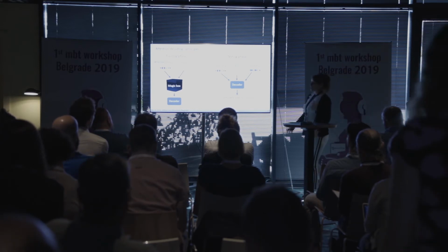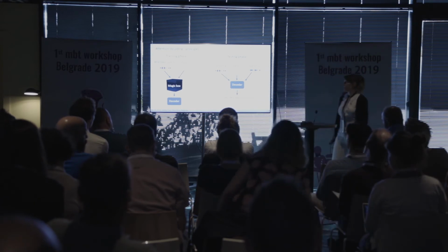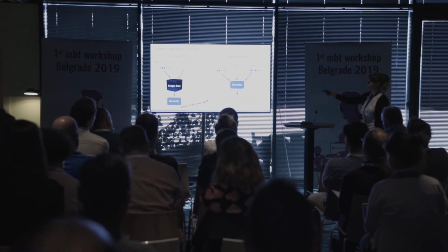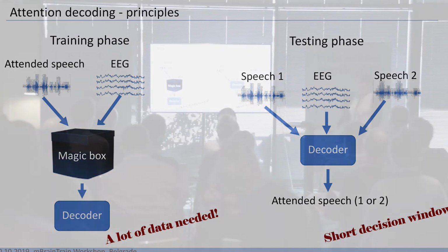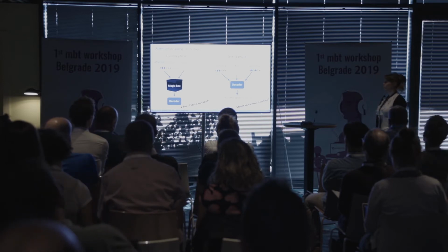The big question is, what do we use here? So what algorithm? Well, there are actually plenty of algorithms by now out there. So for the training phase, we need a lot of data, and for the testing phase, fortunately, we usually need a very short decision window, which means we can probably do this in real time, in real life, which is kind of important for any true BCI application.